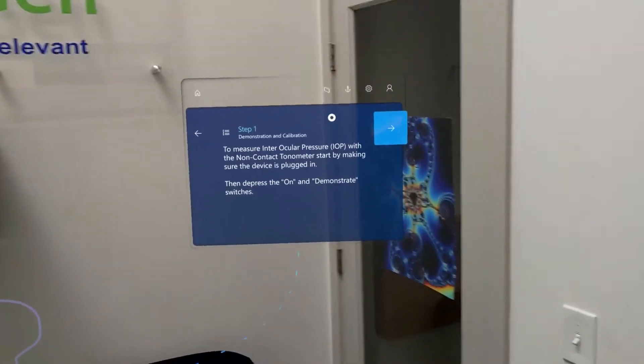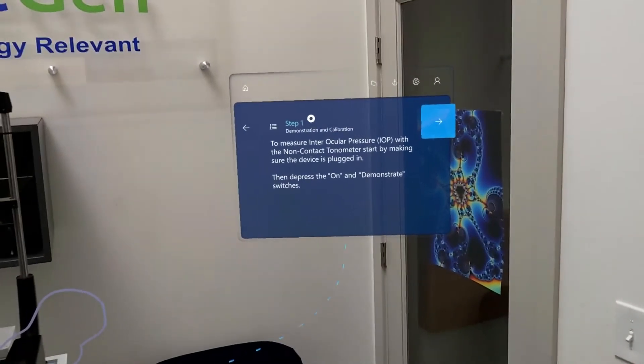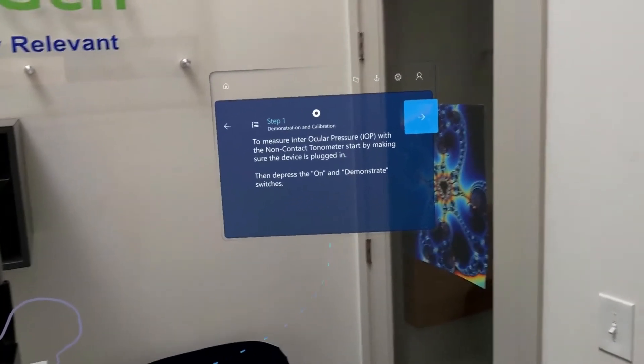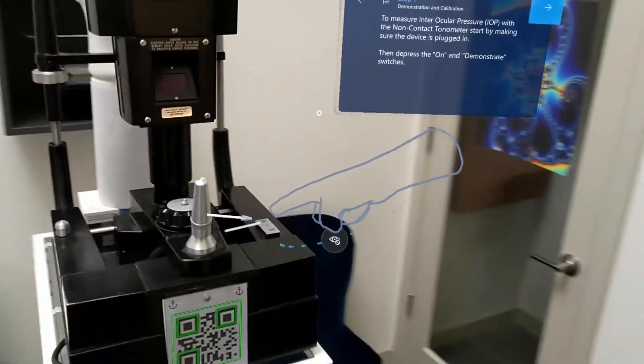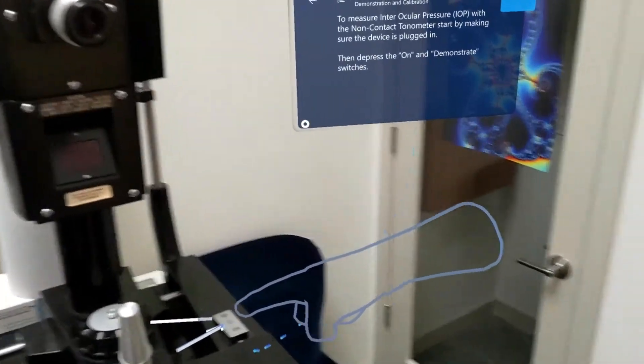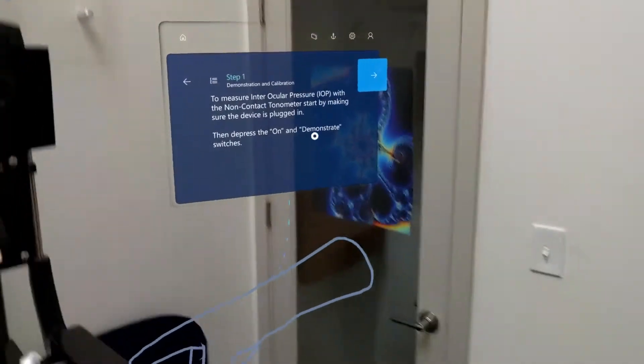To measure the intraocular pressure, IOP, with a non-contact tonometer, start by making sure the device is plugged in, then press the ON and demonstrate switches. Following the daisy chain here, we'll see a mixed reality hand pointing exactly where we need to flip the ON switch. We also have two arrows showing us exactly which buttons we need to operate. That step is done.